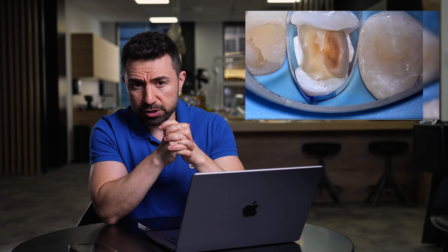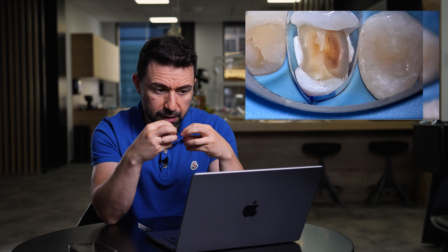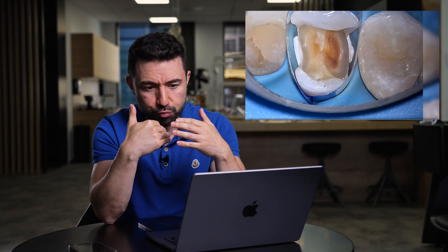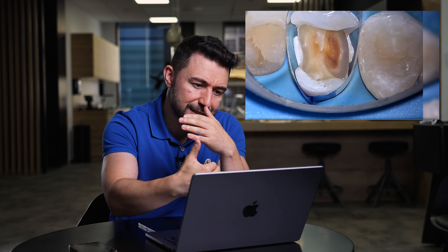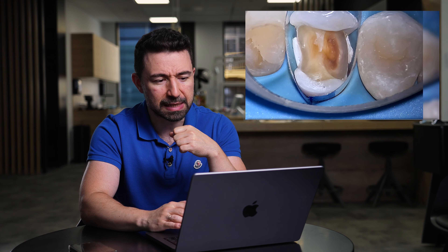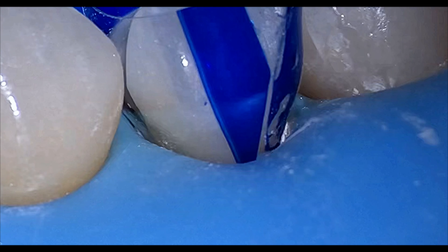But with plastic matrices, once your plastic matrix gets deformation, you can take any kind of rounded instrument and push the matrix from inside out and you will get the correct profile. As you can see in the video, the profile of the matrix is still smooth and very progressive, without overhang.